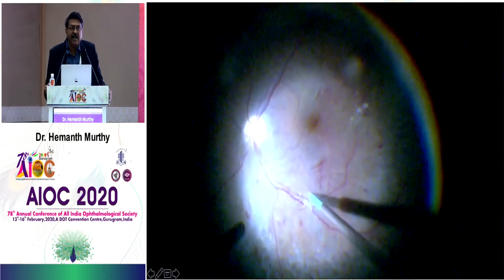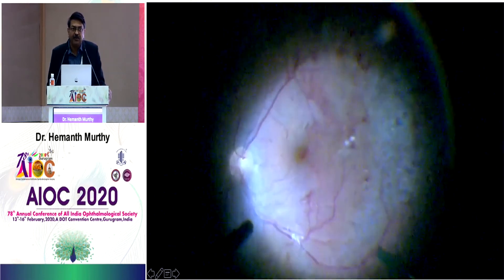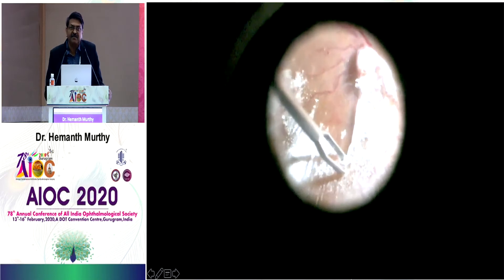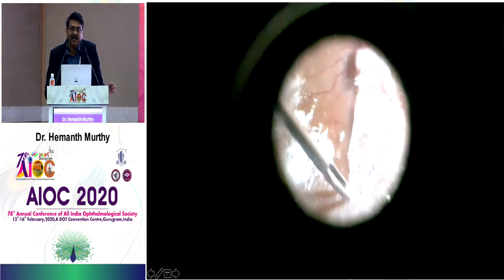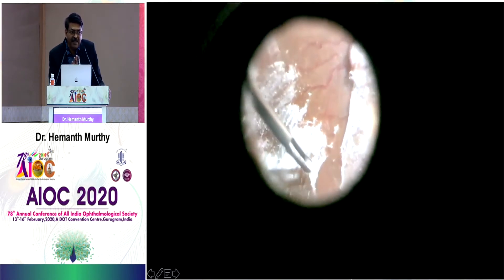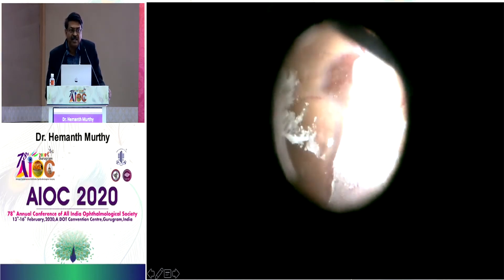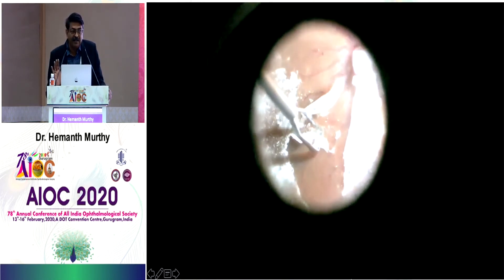This is a patient who had vitreous hemorrhage; I did vitrectomy and at the end of surgery it looked like this. Most of you would say everything looks good, but I stained it with triamcinolone and you can see the vitreous face is still present. Vitreous hemorrhage is very common in diabetics — you need to stain with triamcinolone to identify this posterior hyaloid membrane and only then can you complete your vitrectomy.